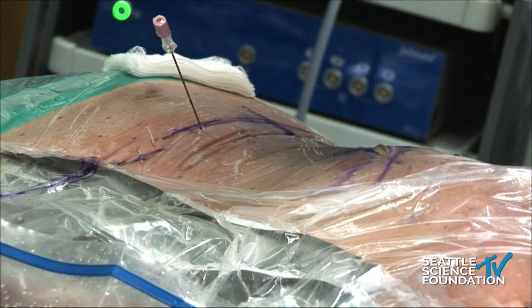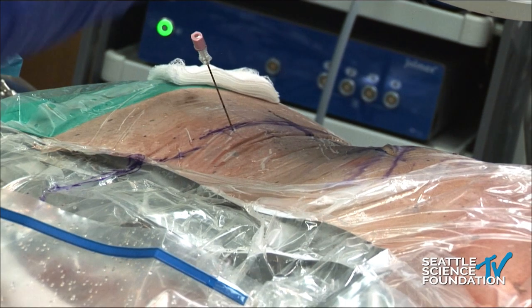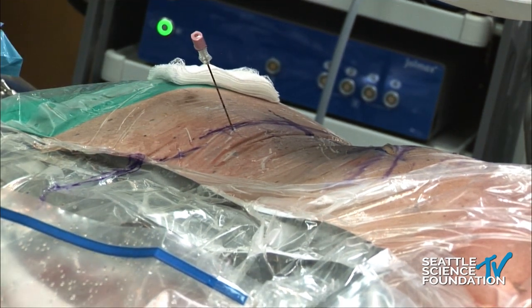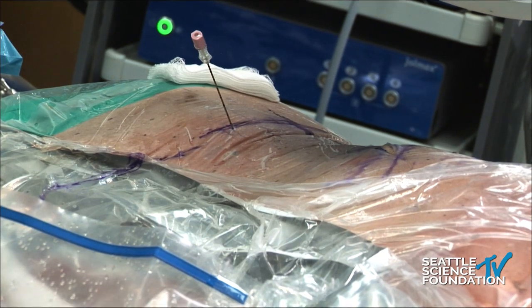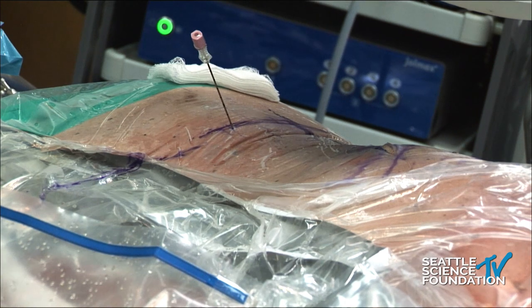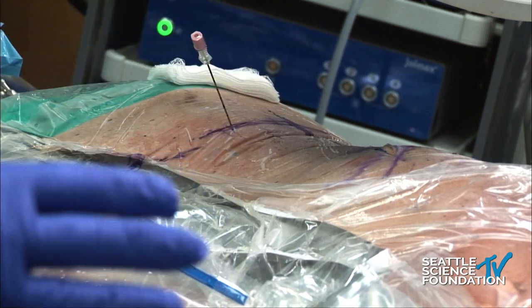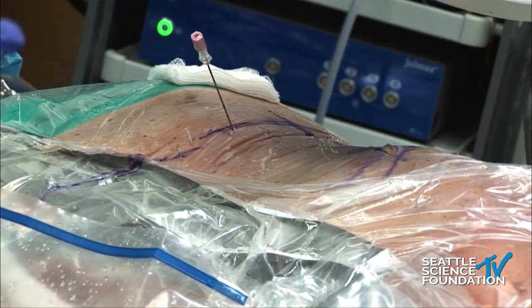The line on the lateral part and the line on the AP define a plane. That's the plane of the disc. So I do this so I can visualize the disc plane, so that when my instruments are working, they should be parallel to both lines at all times because you're going to be in the disc. If you notice that your scope is pointed in a different direction, you're in the wrong spot. So it's an external cue that keeps you working in the same plane.